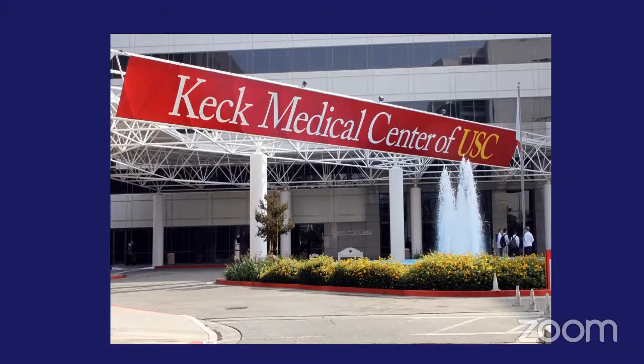There is one question from one of our viewers who wants to know what your experience is with HSP70 as far as diagnosing these lesions are concerned. How often do you use it? Because not many labs have that immunostaining.